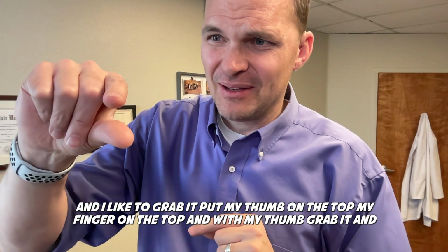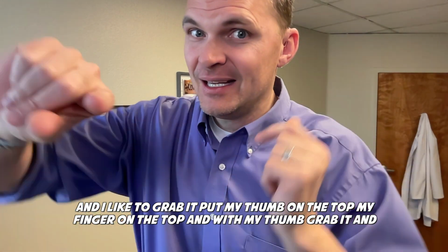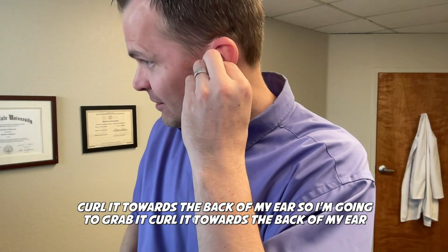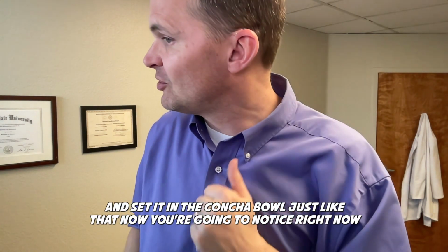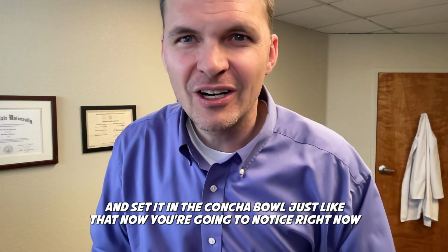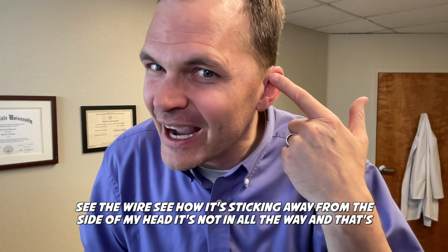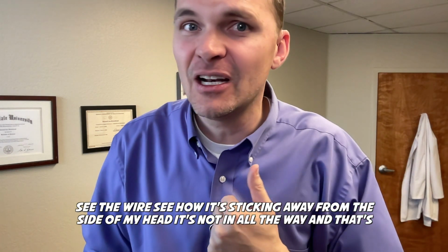And I like to grab it, put my thumb on the top, or my finger on the top, and with my thumb, grab it and curl it towards the back of my ear. So I'm going to grab it, curl it towards the back of my ear, and set it in the concha bowl just like that. Now you're going to notice right now, see the wire? See how it's sticking away from the side of my head? It's not in all the way.